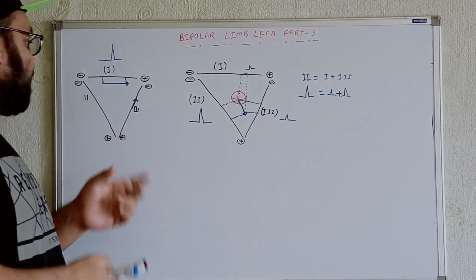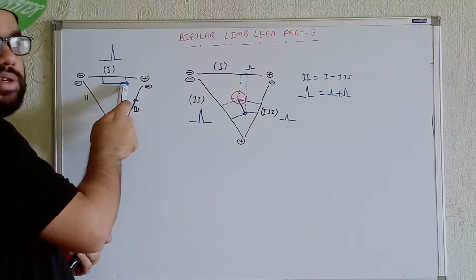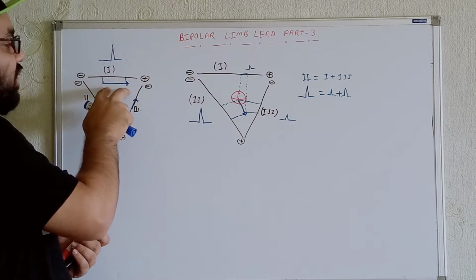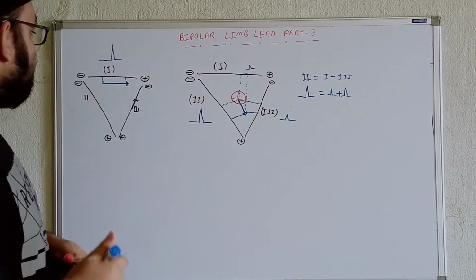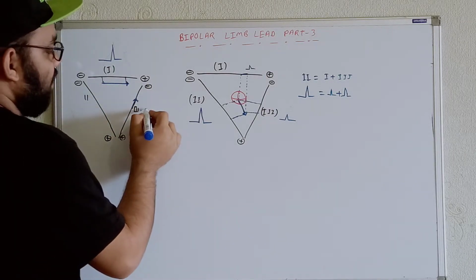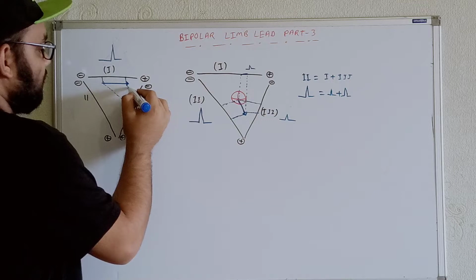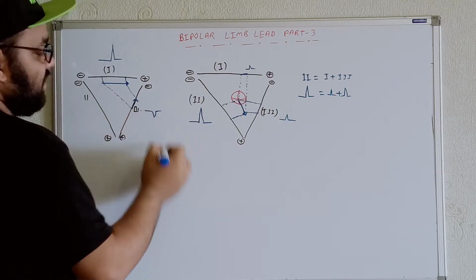But here, if we get, for example, the pathological ventricular depolarization in this direction, that is parallel to lead number 1 in this case, so we will get the major ventricular depolarization over here, and for lead number 1 we will get much more deflection over here. But if you talk in terms of lead number 3, try to understand, the direction will be opposite for it, so we will get very little perpendicular portion from here. As a result we will get the negative depolarization in these directions.